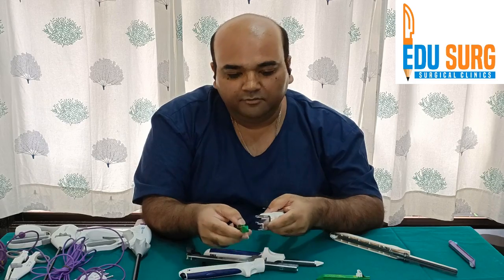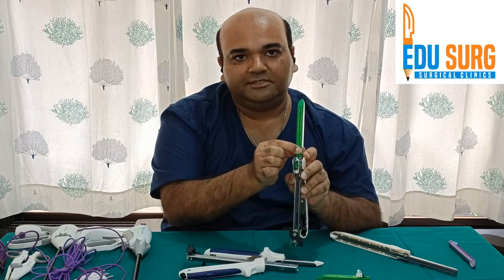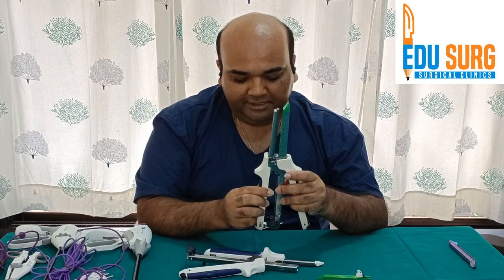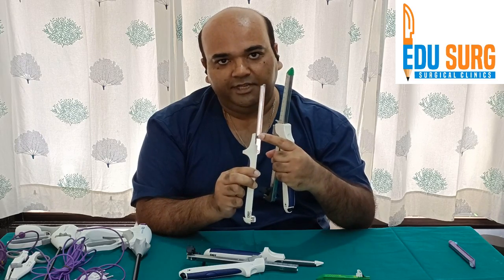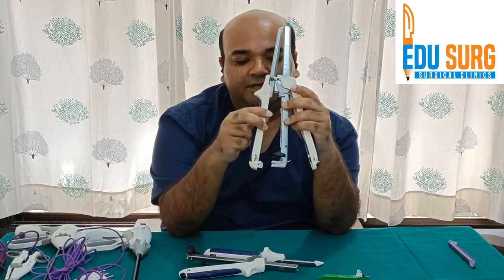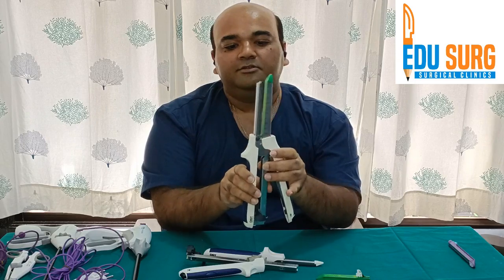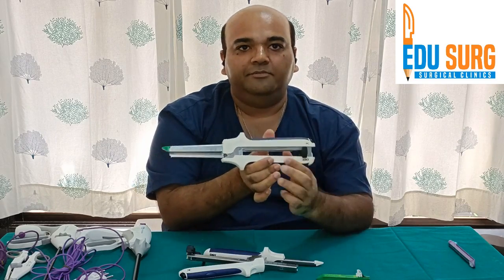To load the stapler again: you fix the nozzle first, then press the stapler so the cartridge is loaded. Keep this open. Then you take the anvil end and fix it so that it locks. There is a black knob in the anvil end and you have to put it in the groove provided. Similarly, at the back end there is a knob in the anvil and a groove on the stapling side — you fix these two together. Once fixed properly, the stapler can be locked.